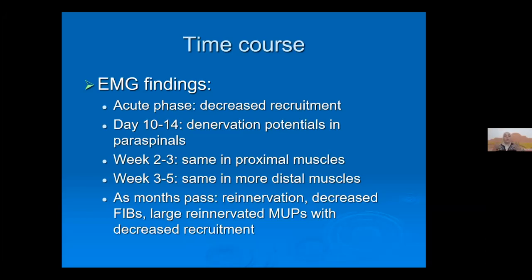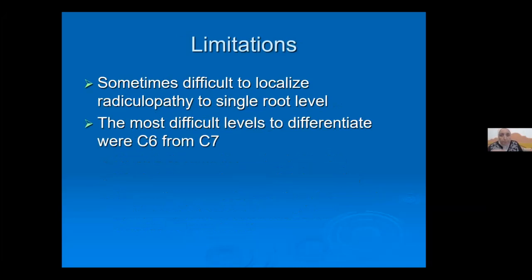As the months pass, there will be re-innervation motor unit potentials. These are delayed, prolonged duration, maybe large in amplitude, polyphasic motor unit potentials. Of course, the fibrillation potentials will decrease, and the recruitment will still be reduced, and it will be even more reduced than before.